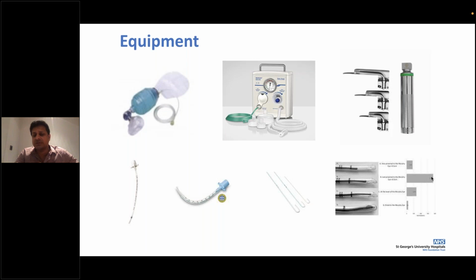It's not uncommon to have inadvertently high PEEP. Let's say when you go into a scenario, you have your PEEP in your neopuff, you haven't really checked it, and it is actually set at 10. In that case, you're not going to ventilate this baby effectively. Although your tube is in, you may not necessarily be able to inflate the lungs properly, or get the effective gas exchange that is needed.